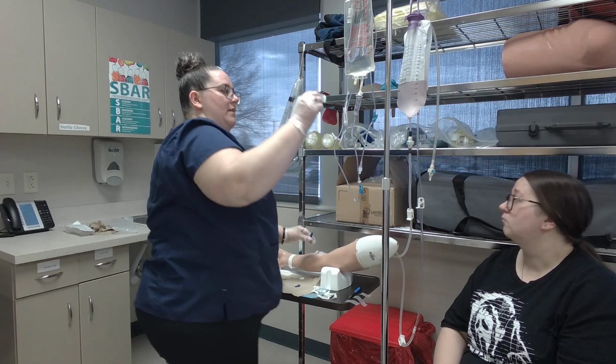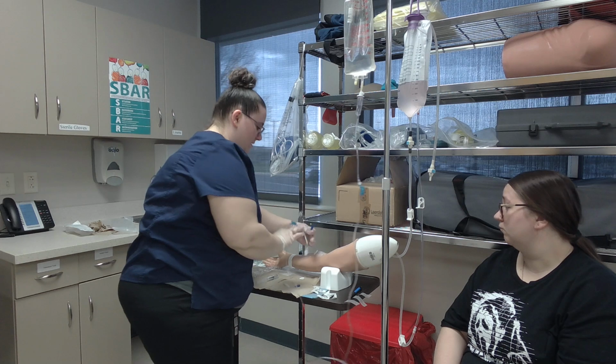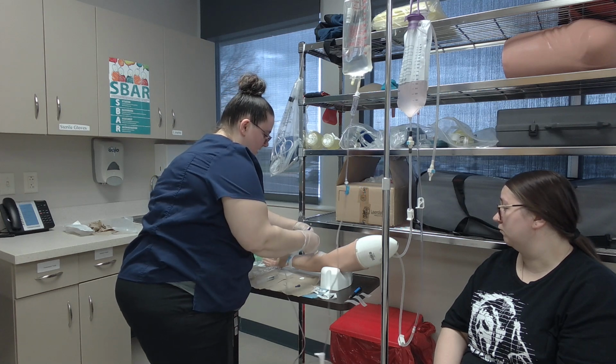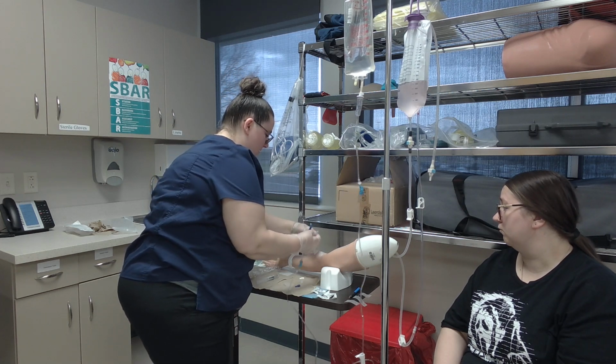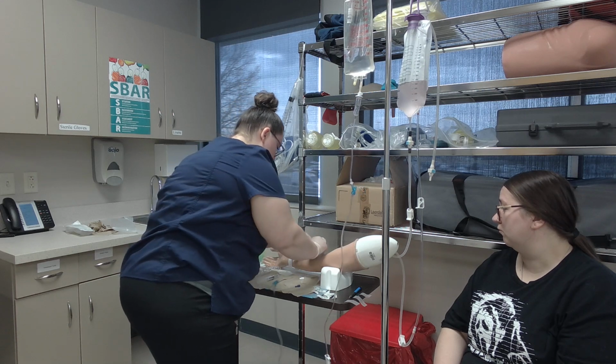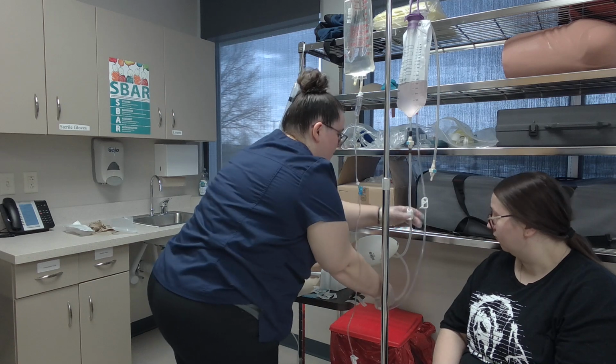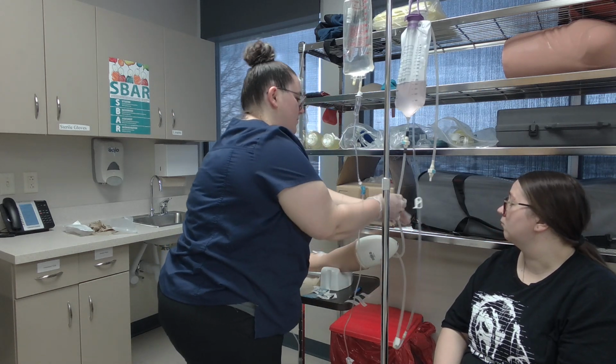So after I do that, I'm going to hook up my tubing without touching anything. Hook that up. And I want to make sure I have all my clamps open. So my clamps are all open so we can have everything run through.